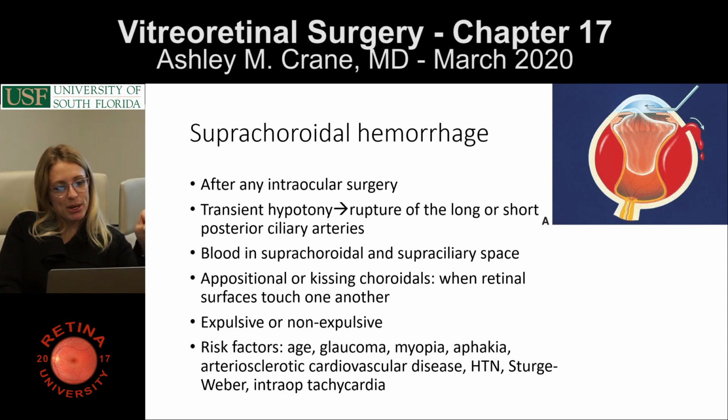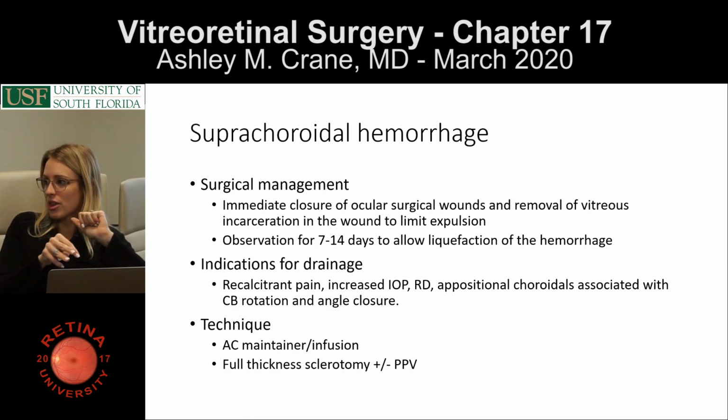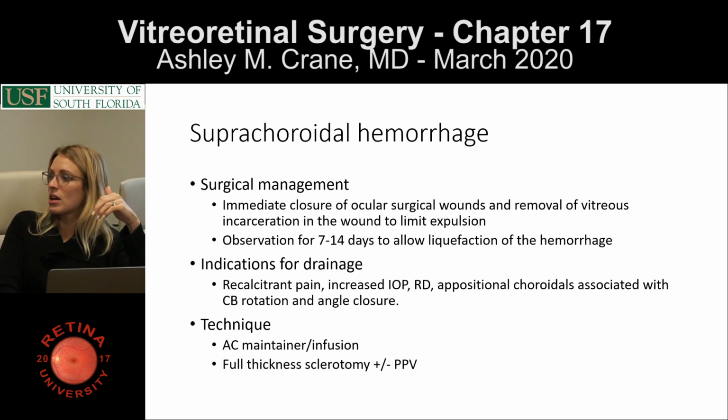Suprachoroidal hemorrhage management. If this happens during a surgery, a glaucoma surgery, a cataract surgery, just stop and close everything. And if it happens afterwards and everything is closed, then it's observation, supportive care for a couple of weeks, and then you can call a vitreoretinal specialist, or sometimes actually the glaucoma people, if they had this, they would drain them themselves.